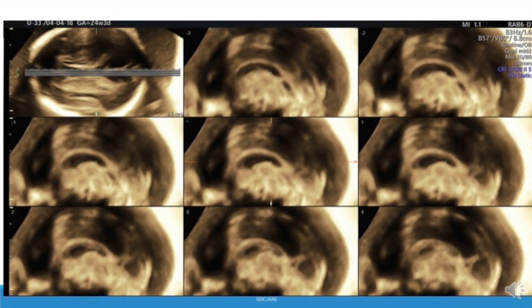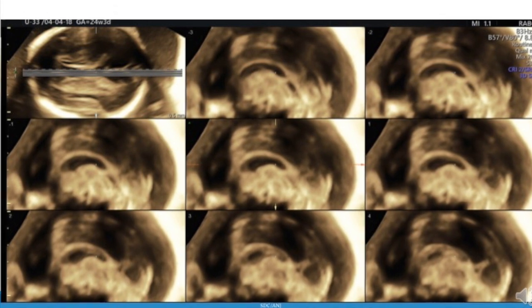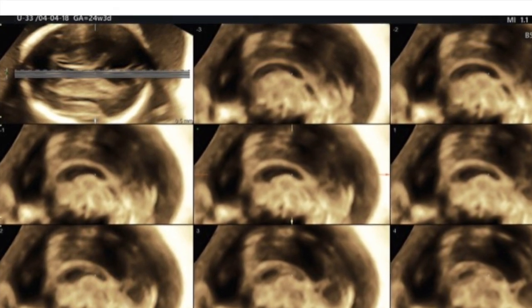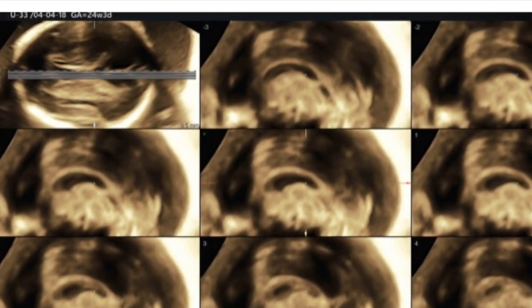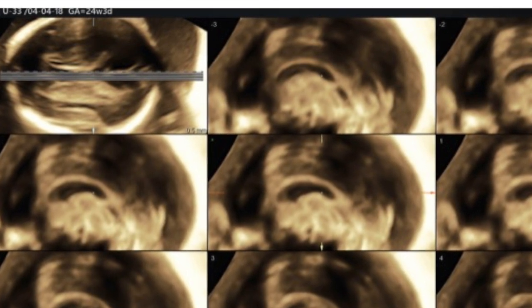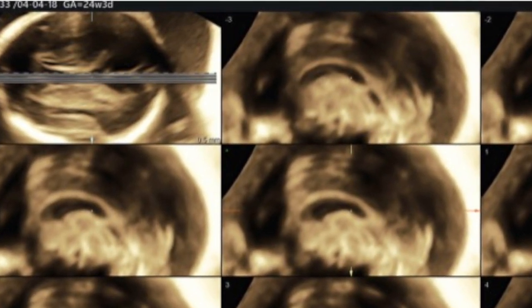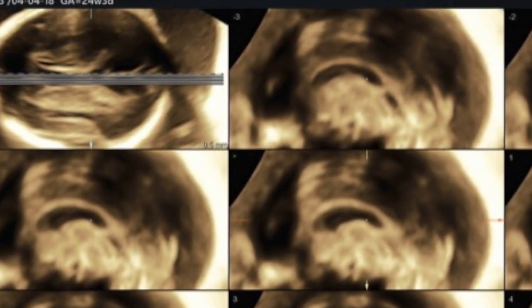Of course, the 3D section helps to know the cavum septum, corpus callosum and midline echo complex together like this. So whenever there is an absent cavum septum pellucidum or agenesis of corpus callosum, you will not see that complex very well. As you can see here, this is the cavum septum pellucidum. Inside this faint line at a shadow, what you see actually will be the corpus callosum, and this is the midline echo of the falx, what you see. So this entire complex is called the CC, CSP, midline echo complex.